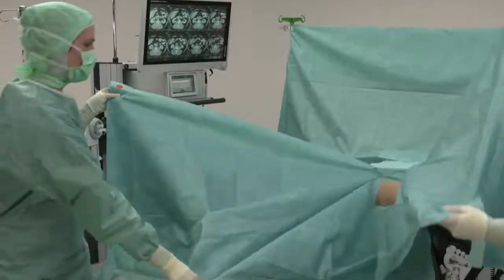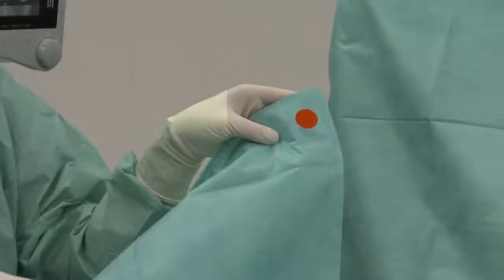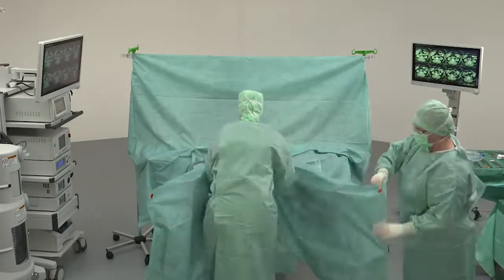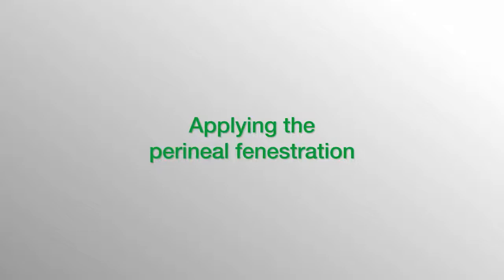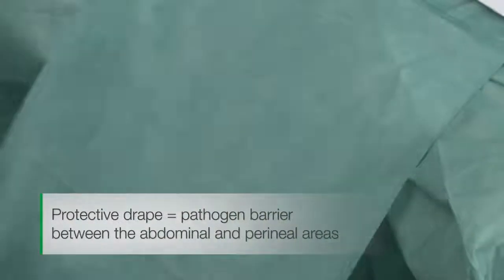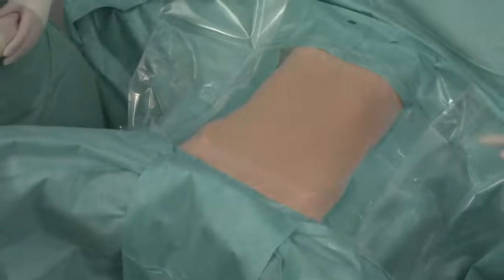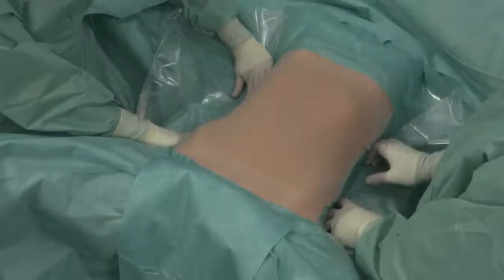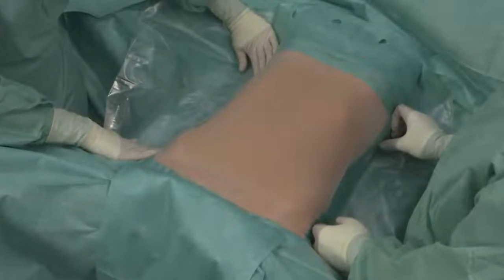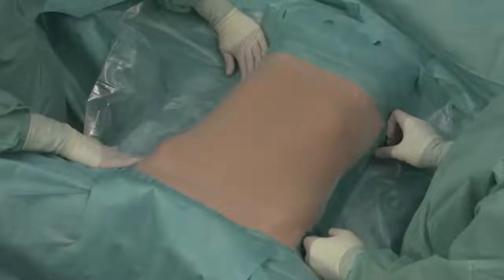Now unfold the leg cover. The red sticker marks the point where the leggings need to be put over the feet. When necessary, fix the protective drape with the adhesive strip provided. The all-in-one drape has an elastic adhesive film. Its flexibility allows it to adjust during CO2 insufflation and ensures it remains adhered to the skin during surgery.